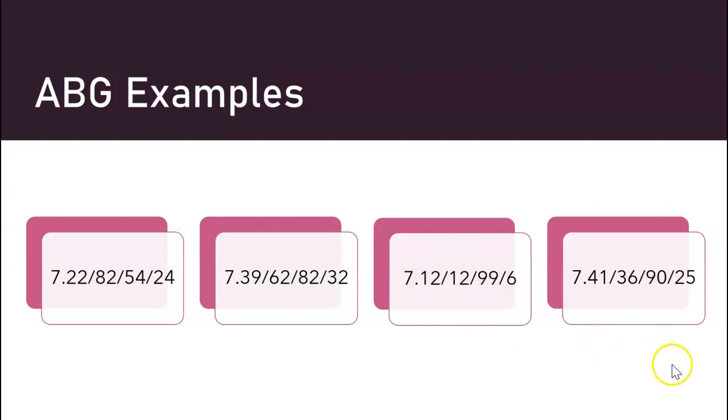All right, moving to this last one. 7.41. Oh, that's beautiful. Oh, that's nice. 36. That's pretty too. 25. Wait a minute, this one's looking a little too pretty. PaO2 of 90. Wait a minute.